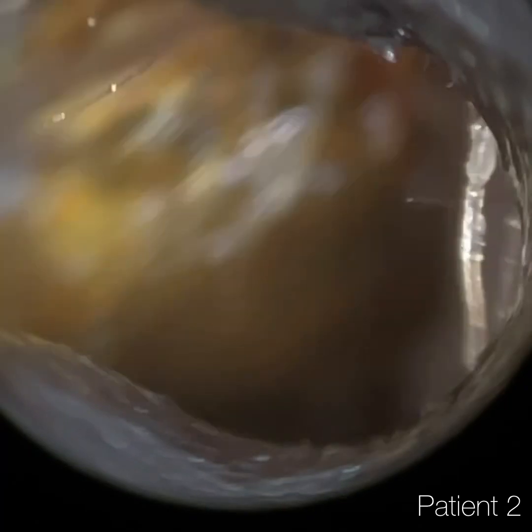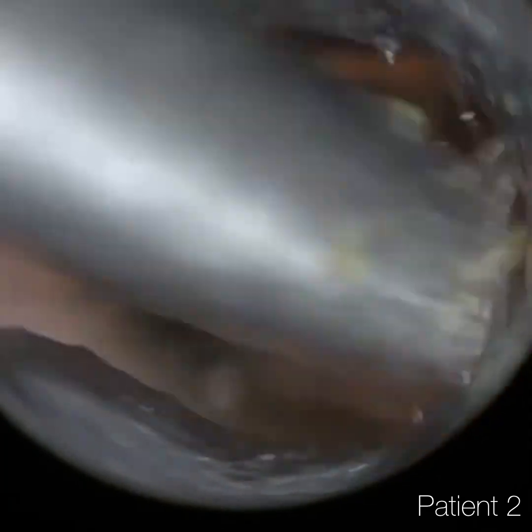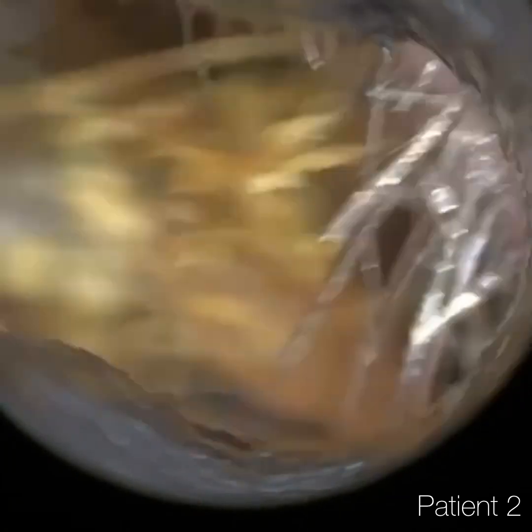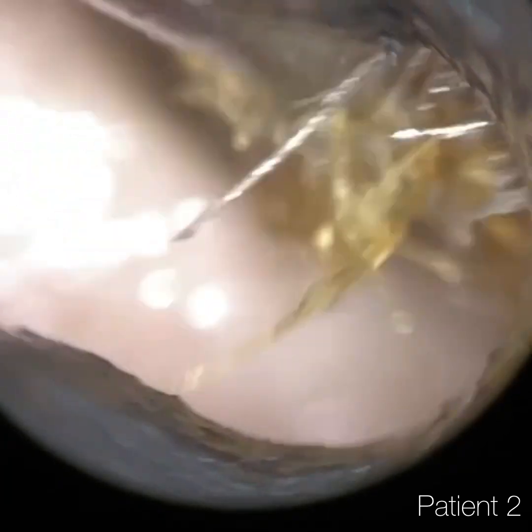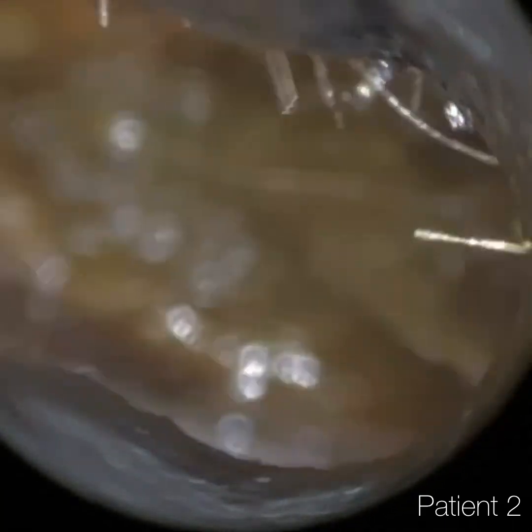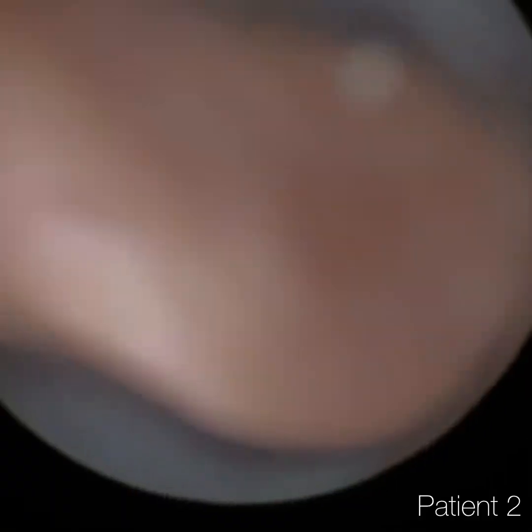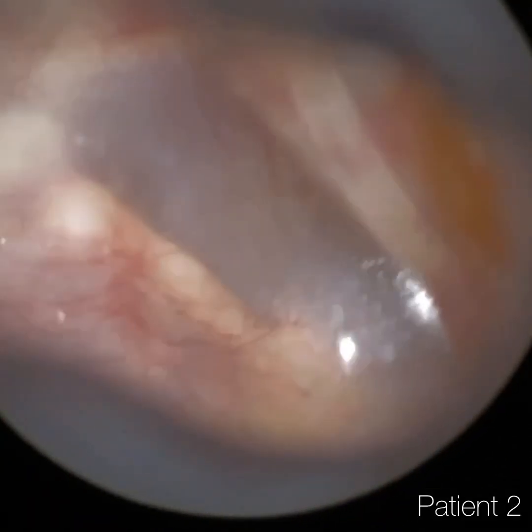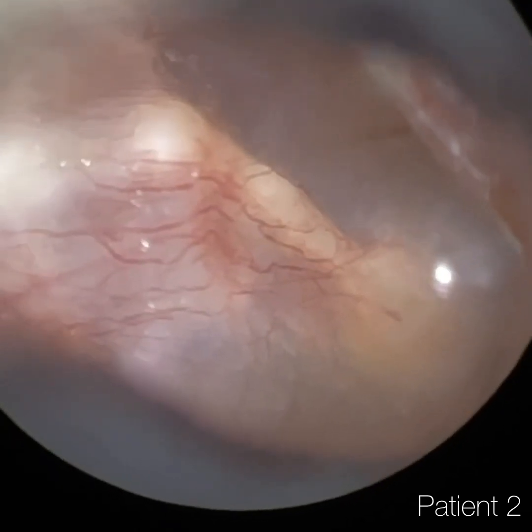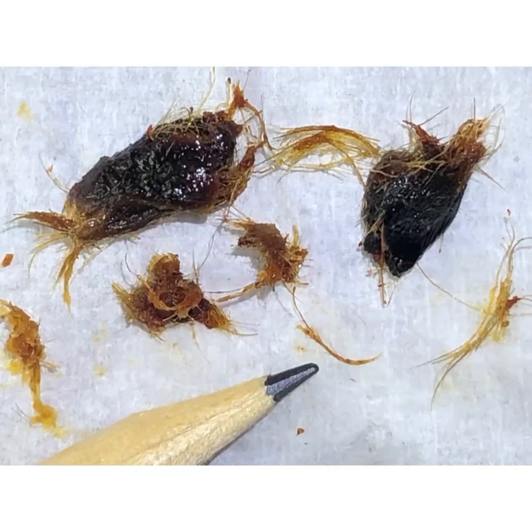And again, I'm just using these wriggle motions just to extract this wax out of the ear canal, make sure it comes out in one piece, hopefully. The head of the wax is now extended beyond the entrance — and there we are, so we're almost there. You can see there are quite a few hairs there. The patient's ear canal on both sides — the entrance at least — was quite narrow, and that's why it's a bit of a tussle. I'm just going to bring it all the way out. This is quite a large plug, and you'll see that on the still image at the end of the video. So we're going to go back in and you're going to see a stunning view of the eardrum now — even more in focus. Even for me, after performing the procedure, it's quite breathtaking to watch it back and see the clarity provided by the Waxscope.